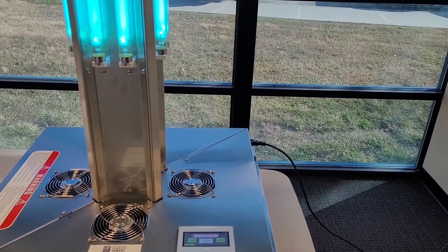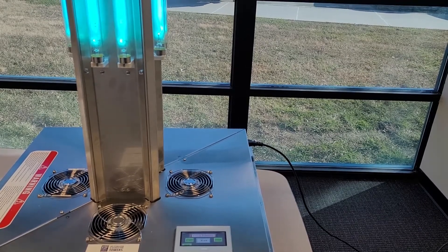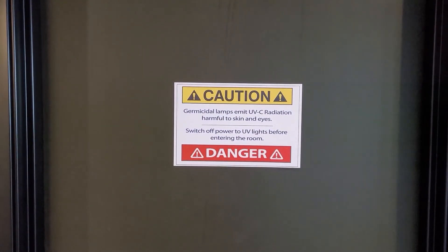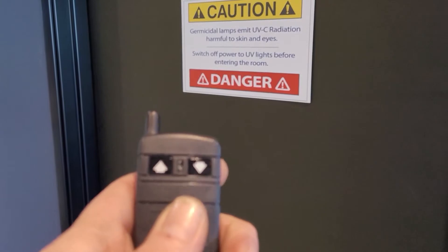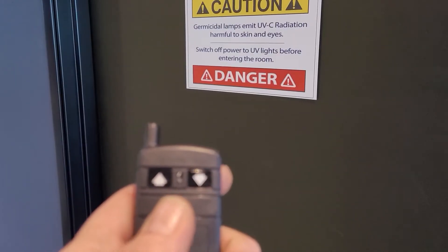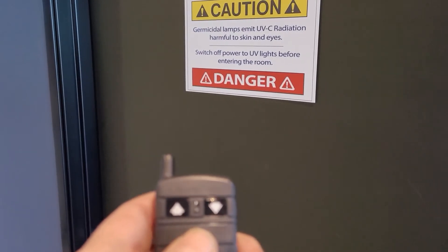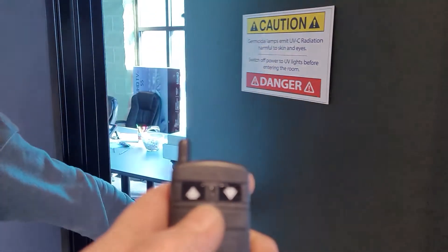Do not be in the room during the disinfection cycle to avoid UV-C exposure. Ensure the UV tower lights are off before re-entering the room. To enter the room before the cycle has completed or to ensure the UV tower lights are off, press the up arrow on the wireless remote. This will terminate the cycle and power off the unit.